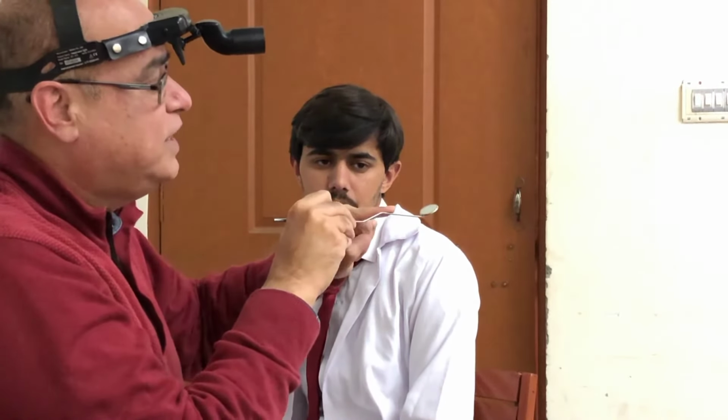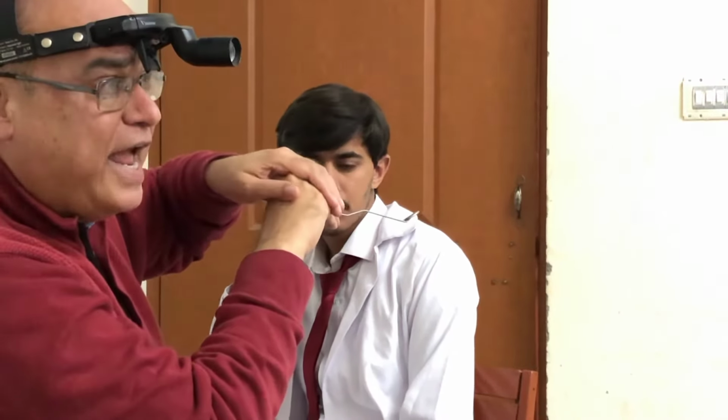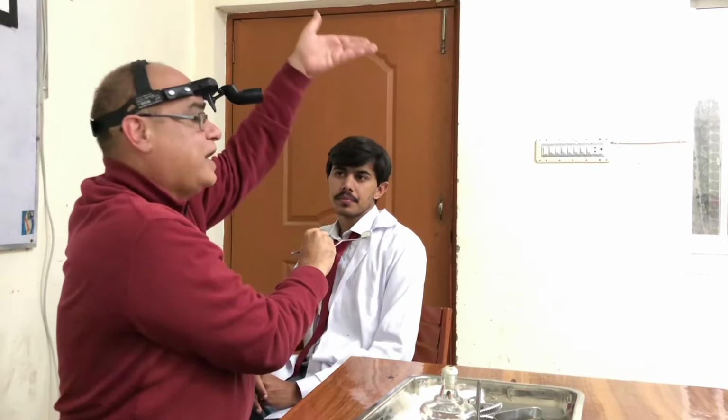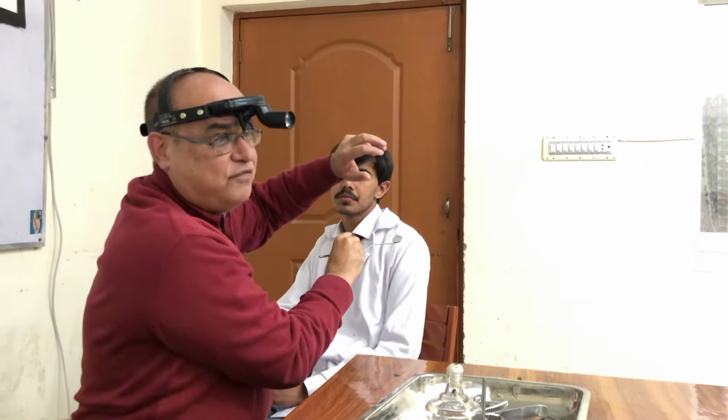For example, if it were straight instead of having this step, the hump of our own hand would hamper our view, because this time we have to go through the mouth. This mirror will be behind the uvula, behind the palate, and we throw the light here. From here, the light will be reflected upwards towards the nasopharynx, and those nasopharyngeal structures will be lit up, and we have to examine that.